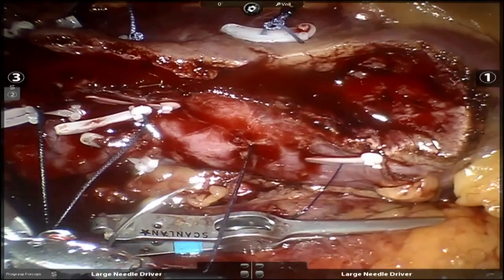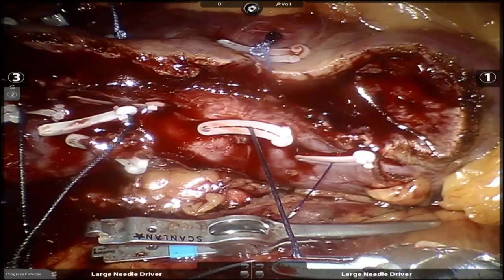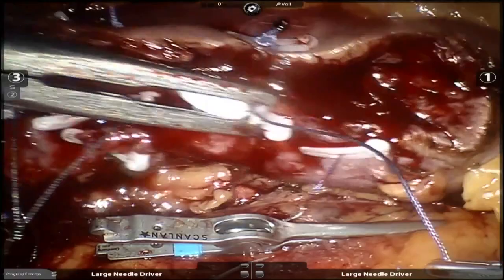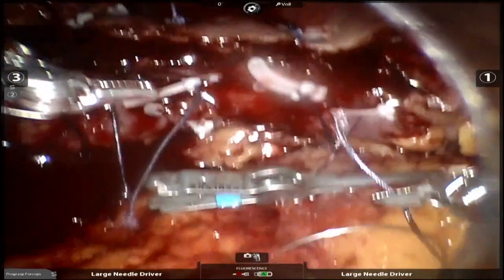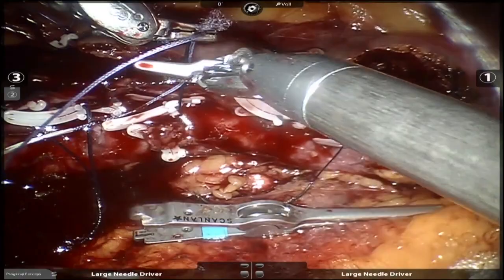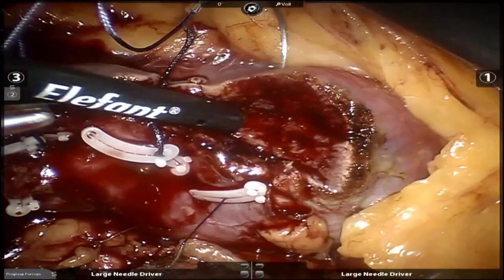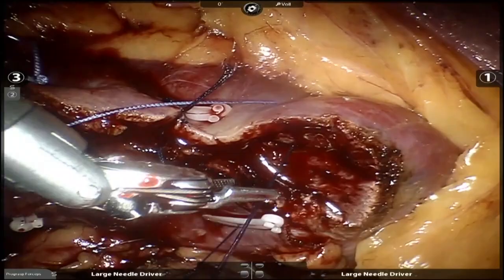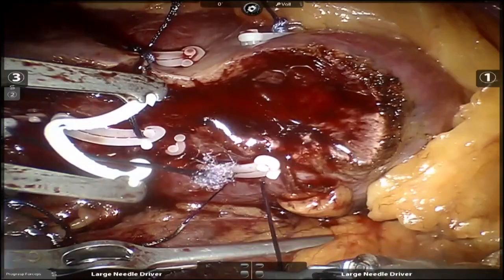What is your philosophy with tissue glues? Tissue glues, for example, fibrin glue or whatsoever. No hemostatic agents. Tissue sealants, hemostatic agents, just sutures. Brandon? Suck. This is like a 2-0 SH that you're using now? Yeah, it's a little bigger needle today, but that's okay. It's an MH needle. We don't have the SH, but that's fine.